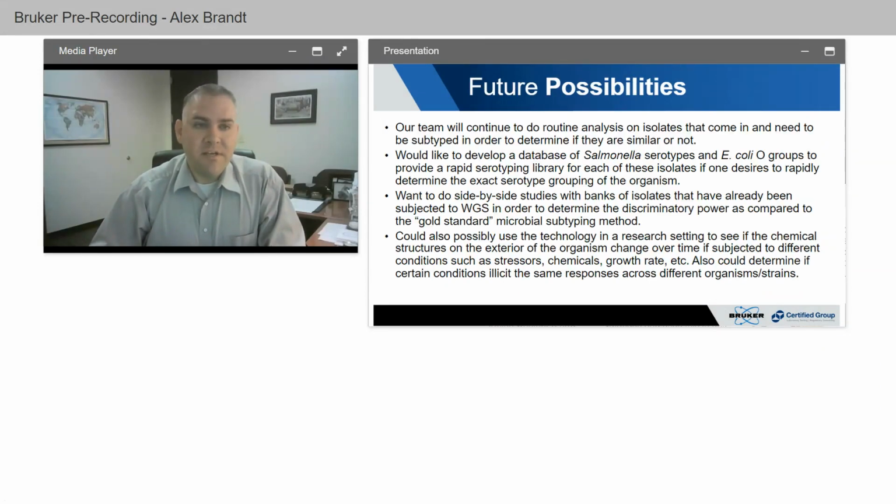So those were 4 different case studies of how we have used the technology in the past, but we also see some future possibilities for how we will use the technology going forward. One of the things our team will continue to do day in, day out is use this for routine analysis of isolates that come in and need to be subtyped in order to determine if they are similar or not. That's what we're currently using it for right now, and we're going to continue using it for that.